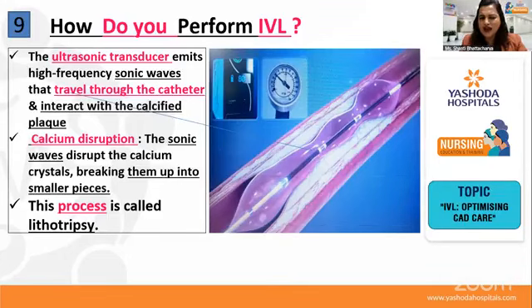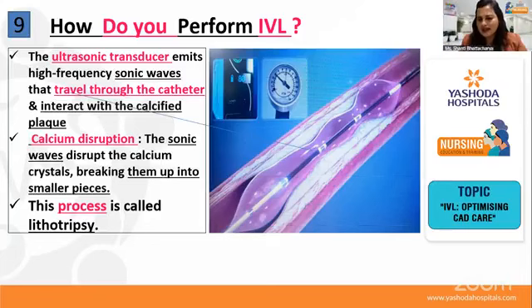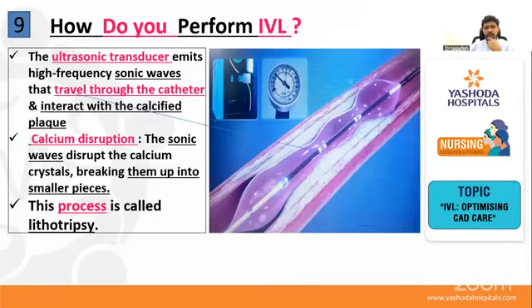A little bit in short, as you have already told. If I understand, this is the transducer, and it uses a high amount of sonic waves, which are sound, and it breaks the calcium. Yeah, true. And this process is called lithotripsy, I guess. Yeah, true, correct. So the center one is a balloon.